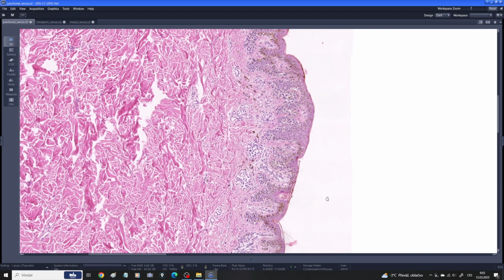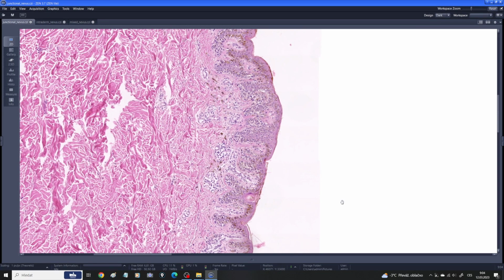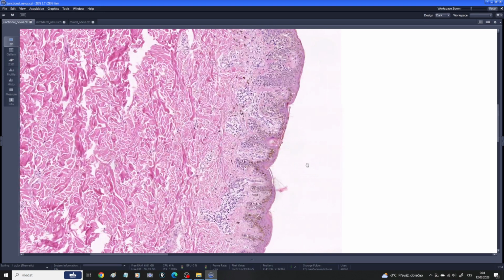Those intradermal nevi, very often they are verrucose, so they form, let's say, a small bulk or small tumor. And very often they lose the pigment. So macroscopically, grossly, dermatoscopically, they are not pigmented anymore, and they can be mistaken for some other lesion. But all of them are completely benign. And how do they look?